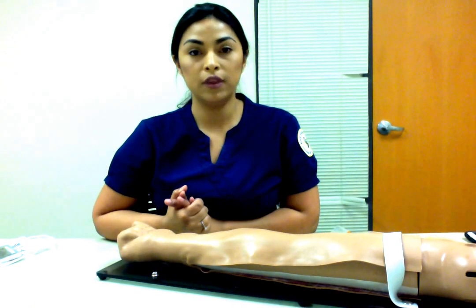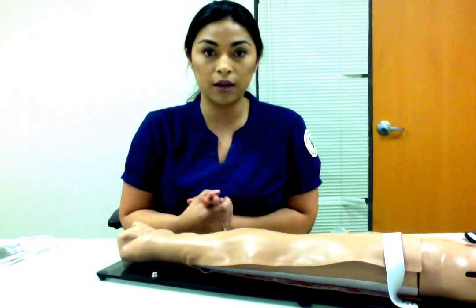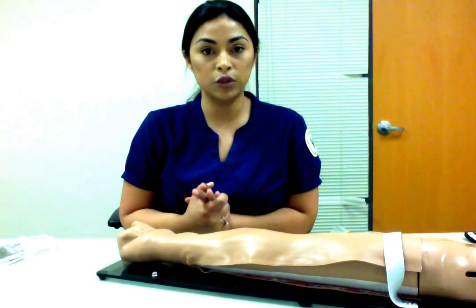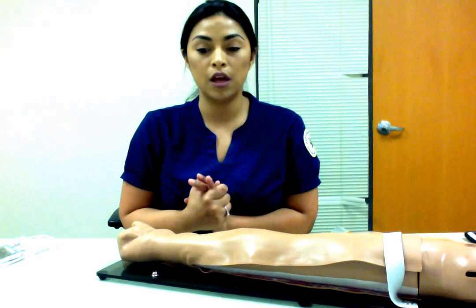The variation in sample size would be according to the blood gas monitor's needs, it may require more or less than 1 cc. Also, when you're performing the test, if a fellow clinician may need blood, it may be a good idea to get more instead of having to have them prick the patient again. So those are the situations that you may need more or less blood from the patient.